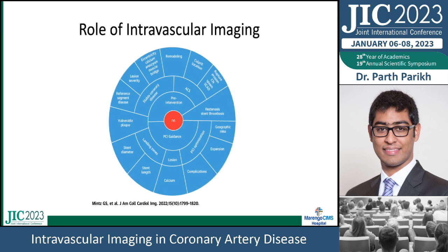In terms of the role of intravascular imaging, it is evolving so much over the last few years that we can see this really well depicts how we can use intravascular imaging in the pre-intervention phase, as well as something that can be used for guidance of PCI for optimal results.